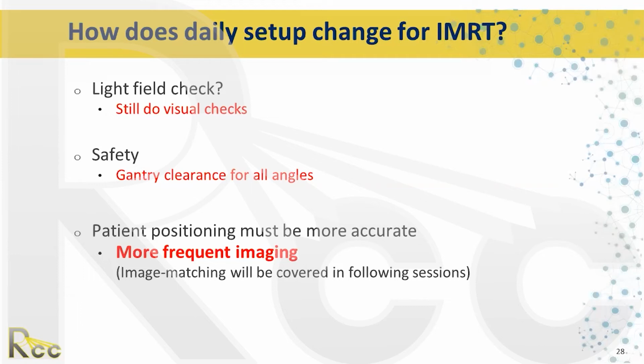It's important to check that before you start, because if you line the patient up and treat the patient mostly, and then you realize, oh, this doesn't clear, then now you're moving the patient in the middle of treatment to get it to clear. So you want to make sure everything clears before you take any x-rays, before you step out of the room.